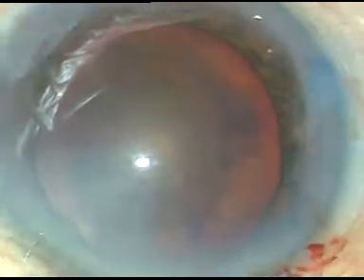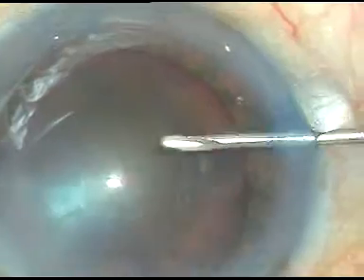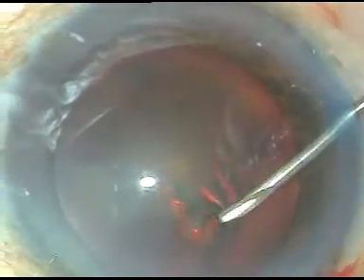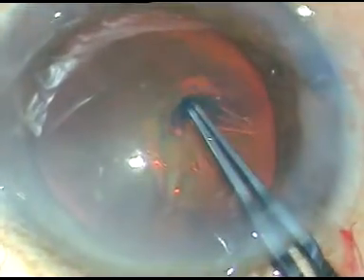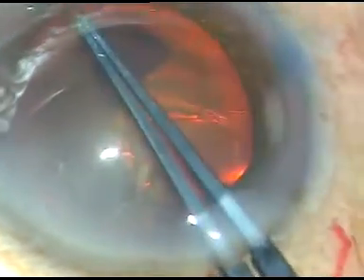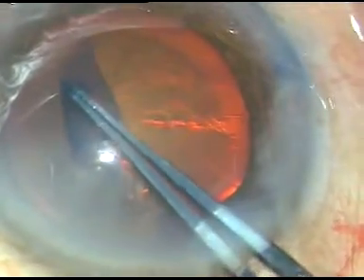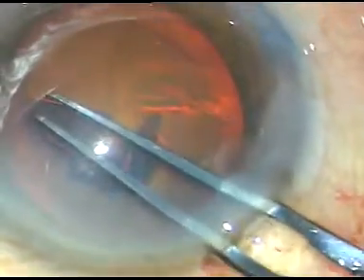Now, through the 8-to-9 o'clock side port, this is the cystotome. It has been used to incise the anterior lens capsule. Now, with the capsulorhexis forceps, as we go here, it wants to go under the iris. Now, this is the smart pull, and after that it comes towards the center and we can complete the rhexis successfully.